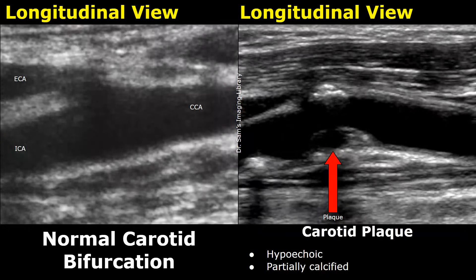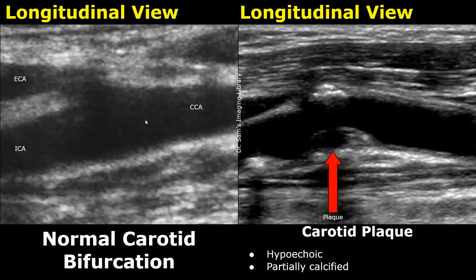Here is a longitudinal view showing the common carotid artery and its branches — the external carotid artery and the internal carotid artery. This is the carotid bifurcation, and over here we have a carotid plaque. It can appear as a hypoechoic structure within the lumen, and may be partially calcified with those calcified areas appearing hyperechoic.